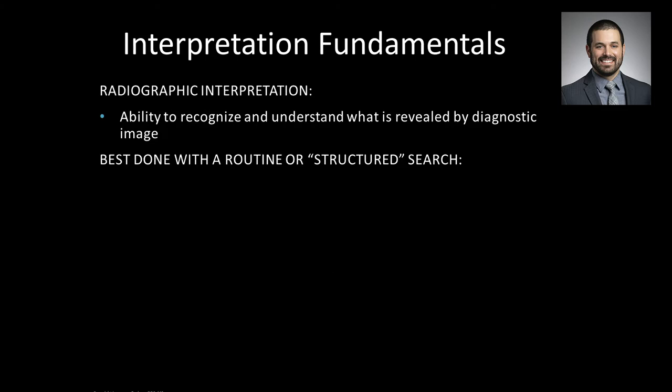Then I'll go side to side with the same patient, with every pass looking at a category of anatomy. And then I'll go front to back. So I triple check myself in those MPR views, and I make a mental checklist of all the abnormalities I want to note in a report.